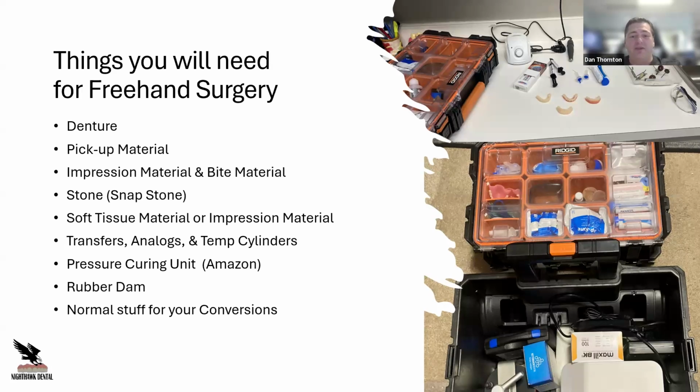And like I said, I normally carry the pressure pot with me. Makes it very easy. Get them on Amazon. A lot of stuff you can actually need for this, you can get on Amazon or some of the other places, going to be a reasonable price. Rubber dams a little bit more. Obviously, you're going to have to go to some of the purveyors for that. I normally like using the thicker rubber dam and not the thin stuff, just for the fact it will give us a little better support for the tissue and a little bit more space underneath when we're backfilling through the acrylic or pickup material.